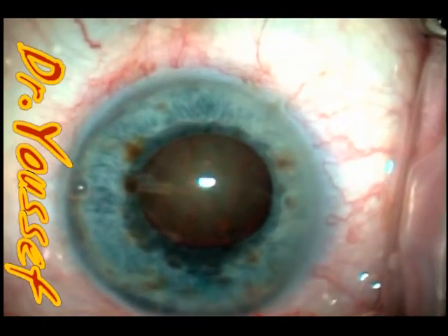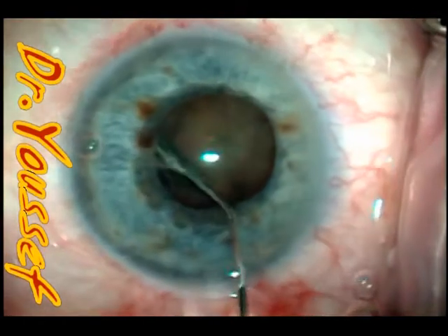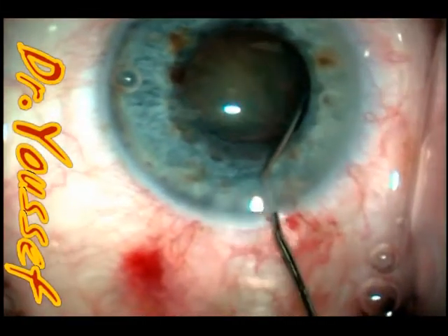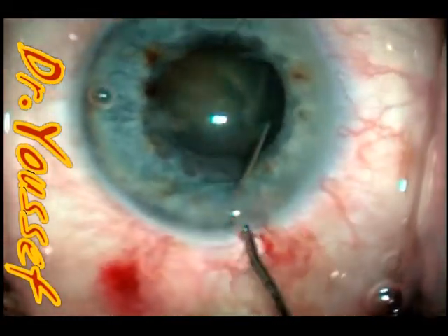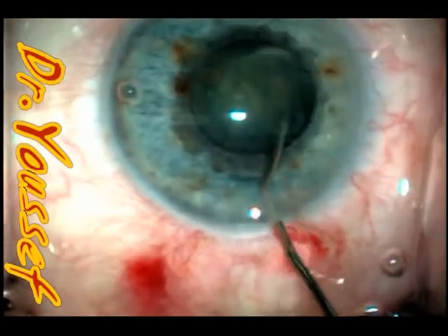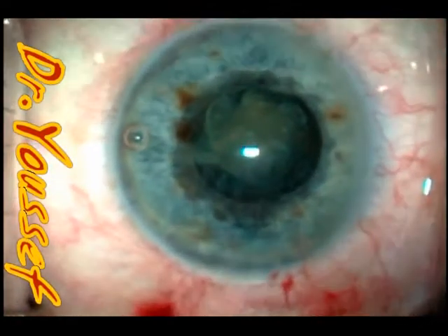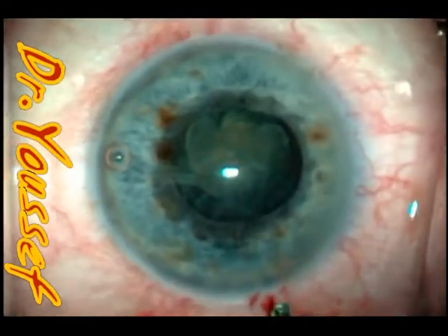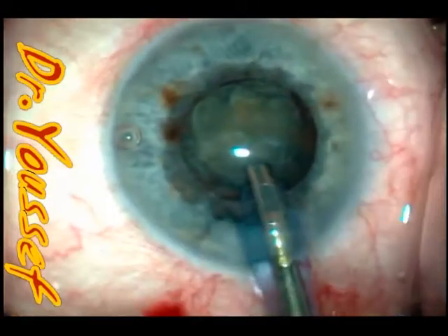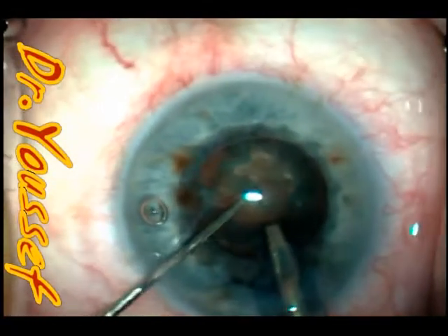Especially if the cataract is not too big, with the help of some instruments we use during the procedure, we can do what we call slow-motion phaco to remove this cataract safely and effectively. It's very important when managing a patient with pseudoexfoliation that you should not put any stress on the zonules, because they are already weak, and any small stress during phaco or lens implantation can result in zonular dialysis, and you may need a capsular tension ring for that. So you have to be very, very gentle.